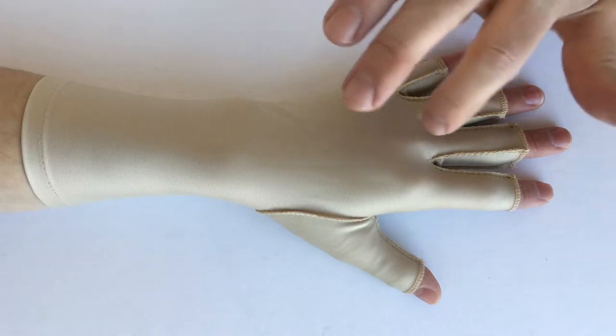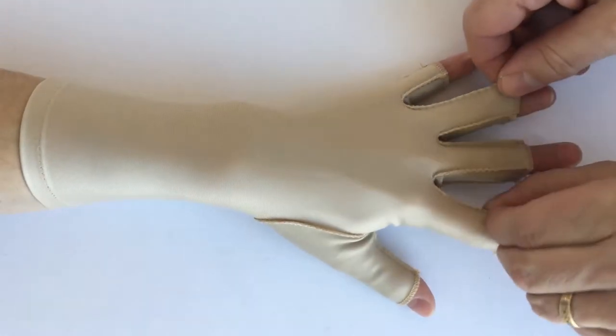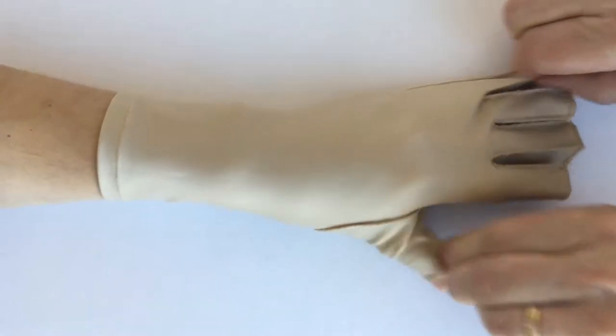Oftentimes, an edema glove will not compress adequately in the web spaces between the fingers, so I'm going to show you a couple of solutions for that.